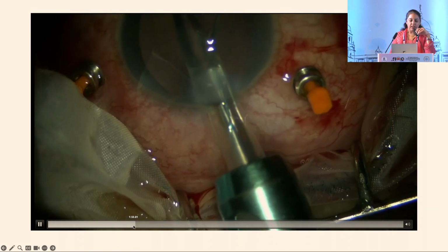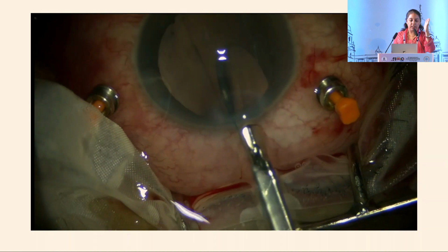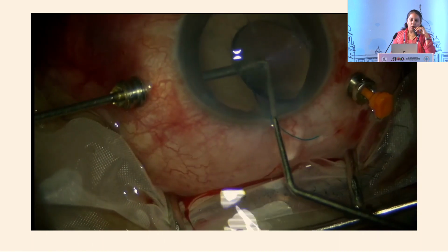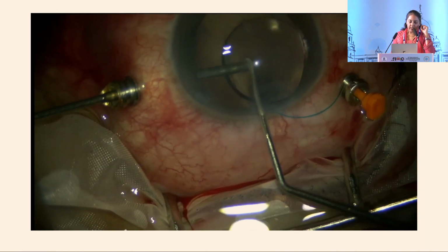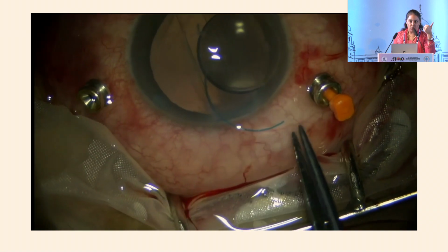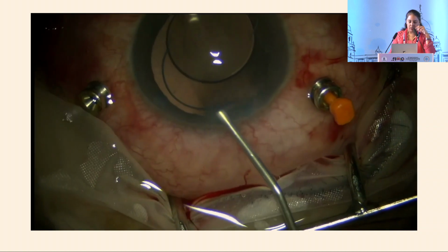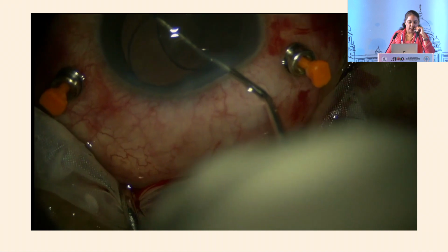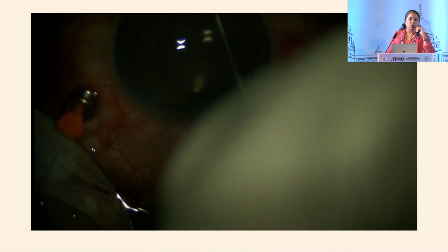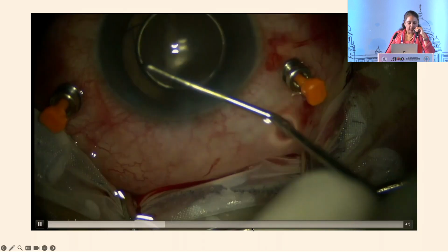So you look here. The problem that you're going to see here is that there is a vertical rip and the IOL just dips down through the rip. A good mechanism to avoid this is you don't insert the whole IOL, keep one haptic out. As a young surgeon, you may also suture, like Dr. Gaurav had shown, into the CTR if you feel that the IOL may not be as stable. However, we are able to dial the IOL well in this case, and therefore the IOL sits well.